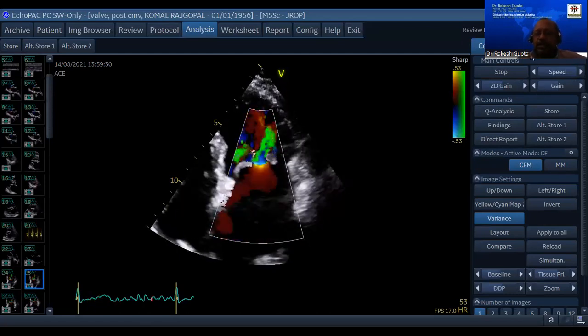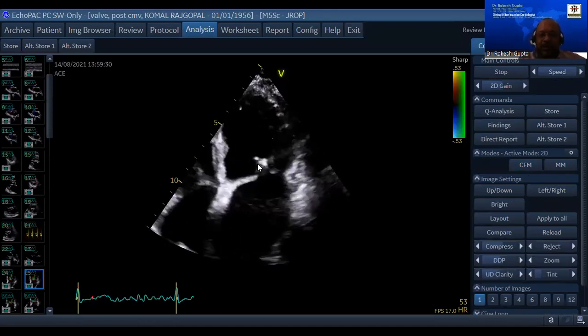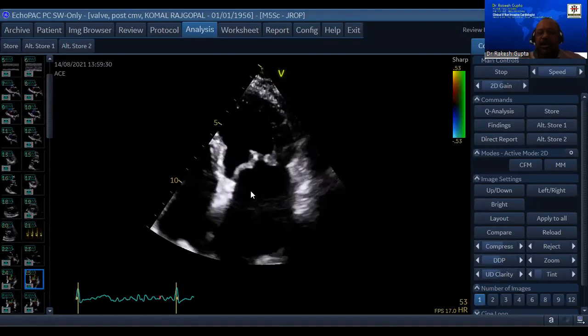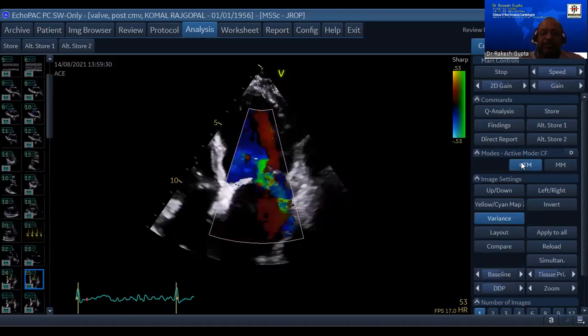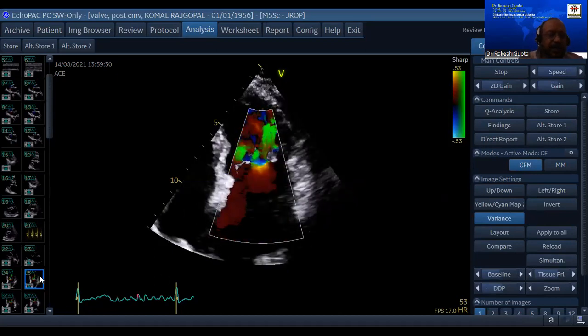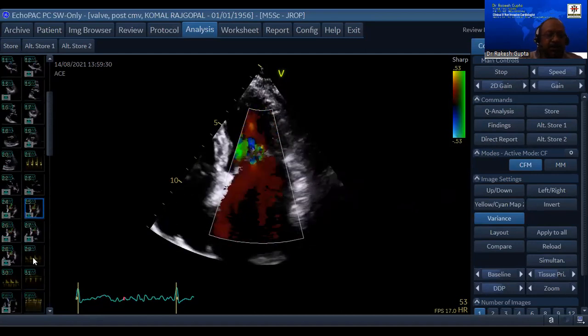So Nida asked this question. Now, this is the same patient who had a closed mitral valvotomy at one time, and now she's back again with us with stenosis. If you see this stenosis again, it is very difficult to talk of a restenosis unless we have a previous existing history. And this lady, I can just show you a mitral.